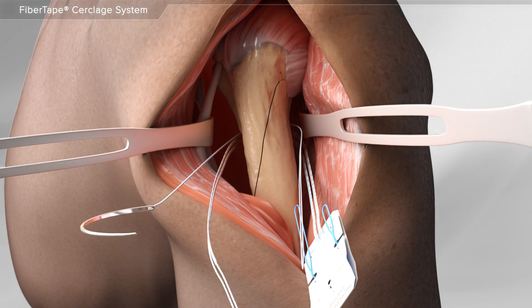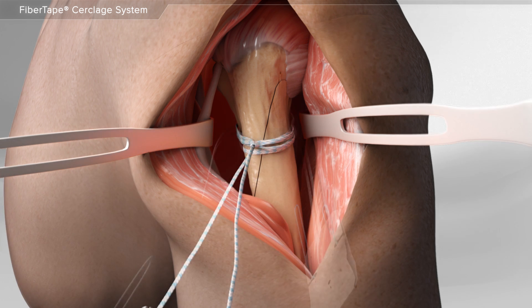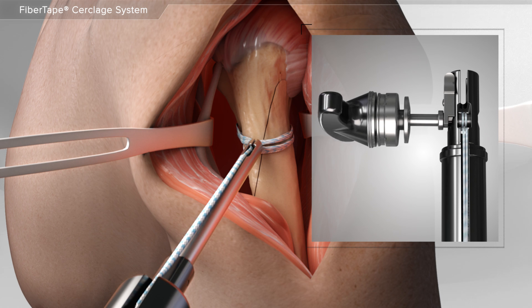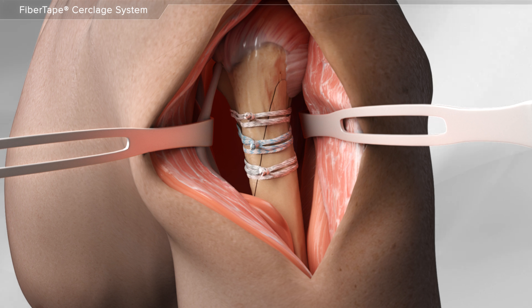Next, the sutures are passed a second time around the bones and then placed into a device to tighten them. Finally, the sutures are tied and the fracture is secured. Your surgeon may use multiple suture tapes if needed.